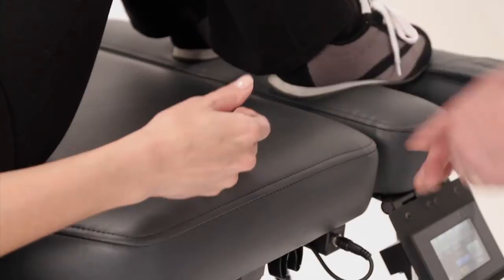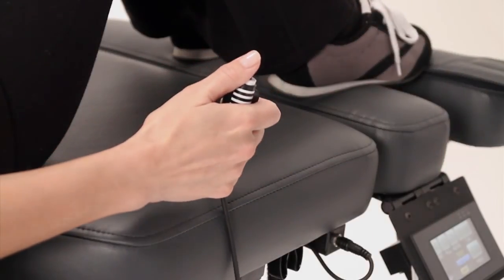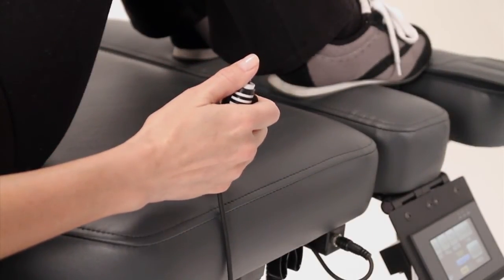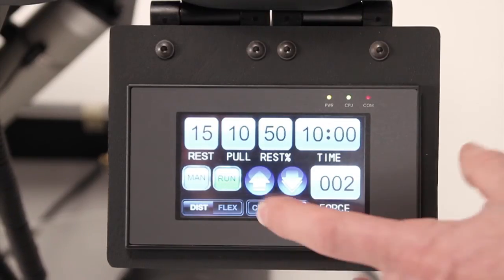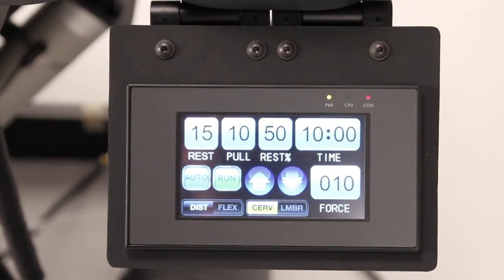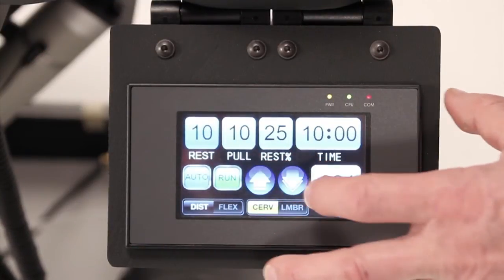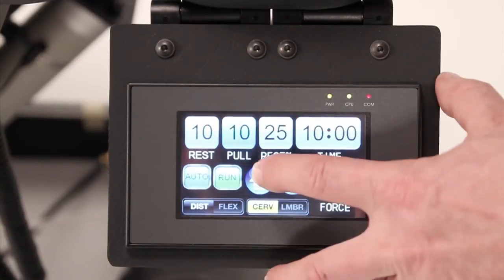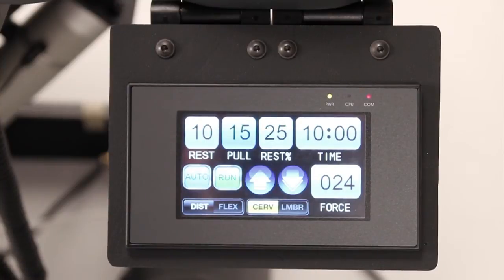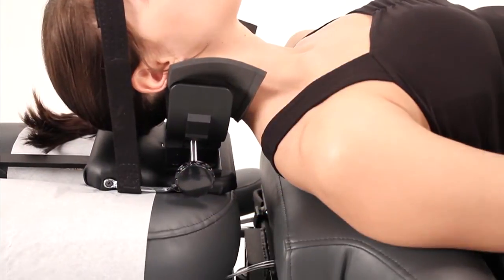If the patient experiences discomfort, they can use the emergency cutoff switch. The table will then stop the treatment and return to a full resting position. To program a cervical treatment, touch cervical to activate the cervical mode. Settings for cervical distraction follow the same procedures as for lumbar distraction. Set your rest time, pull time, rest percentage, treatment time, and force. When all desired settings are entered, touch the green Run button to start the treatment.